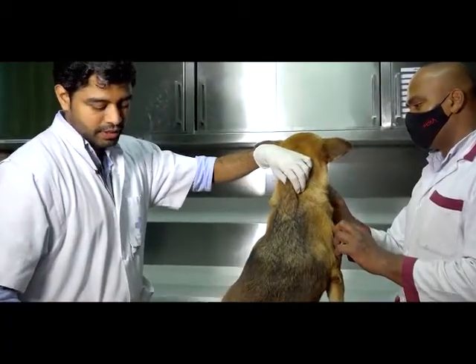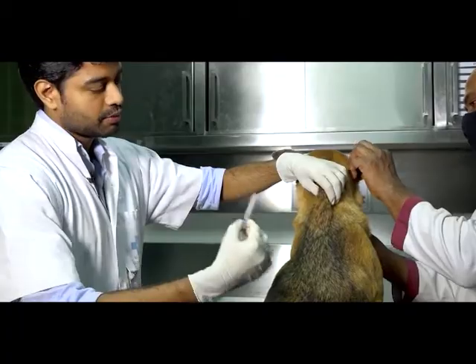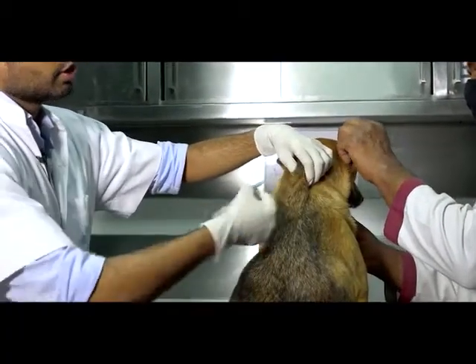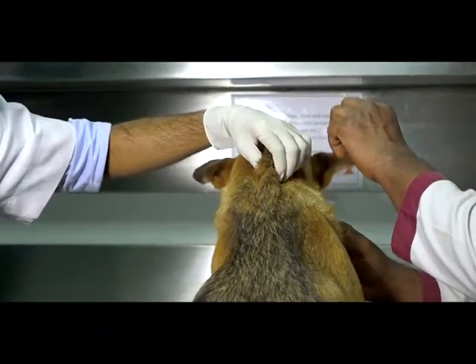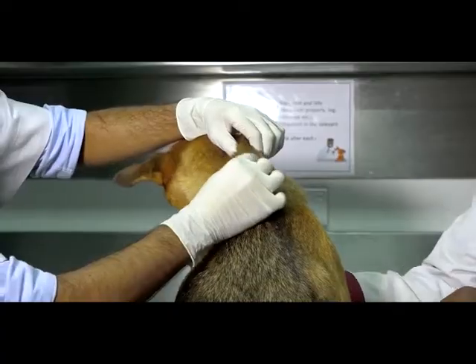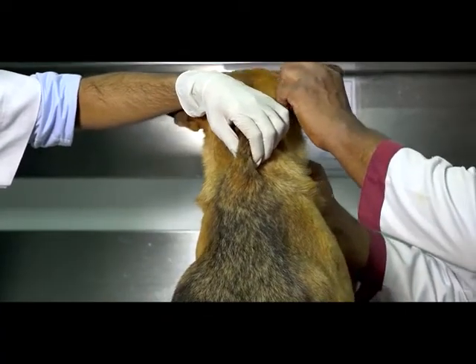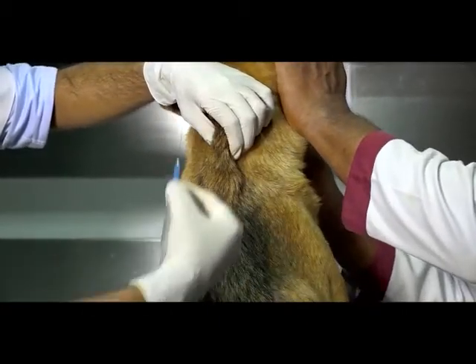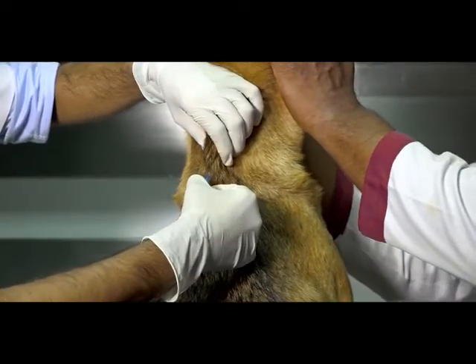And well, before we inject, it's always important to place it along the fold and not perpendicular to the fold. And we would scrub the particular area. And when we administer along the fold, make sure that you maintain a 45 degrees angle along with the surface of the body. Gently place it in.